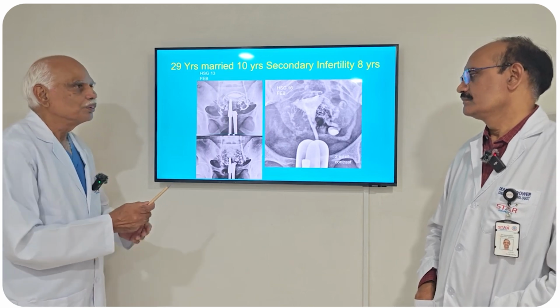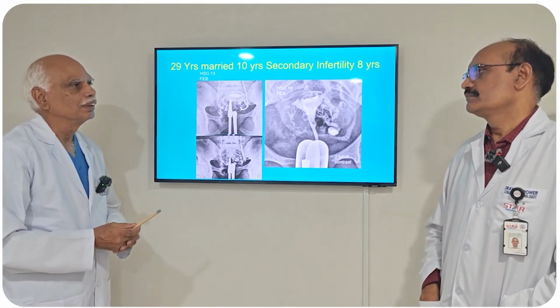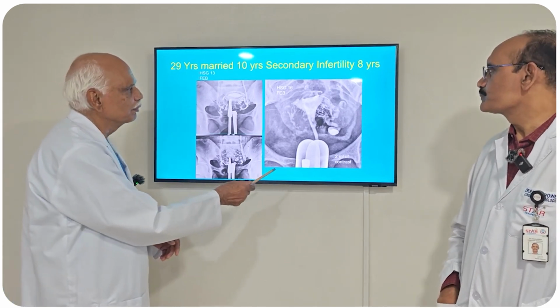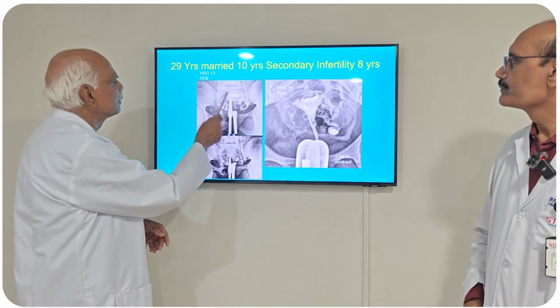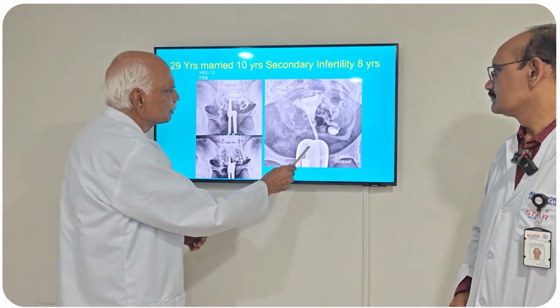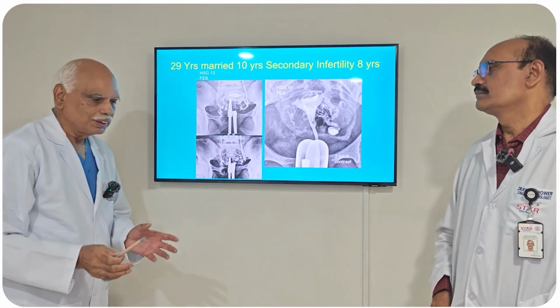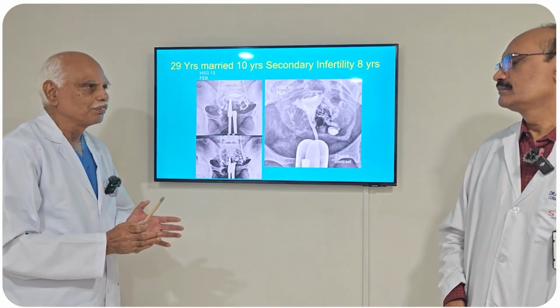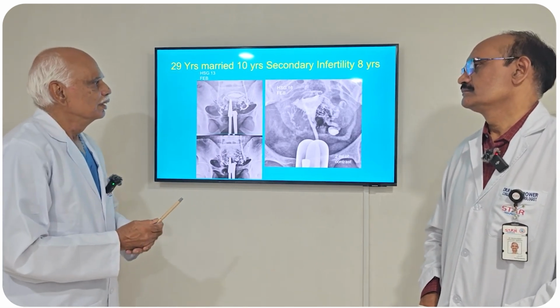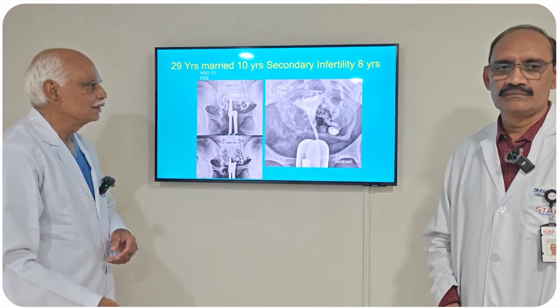In this case, these are all suboptimal hysterosalpingograms done under X-rays without fluoroscopy. Then this patient came again and we repeated it a few days after that. This is done under fluoroscopy. Again, here also you are seeing the intravasation. Sometimes even a small tubal uterine pressure gives rise to intravasation. So in this case we immediately stop injecting. Next.